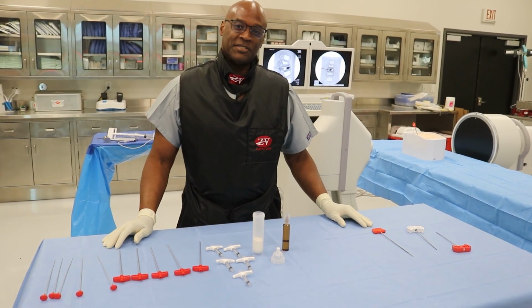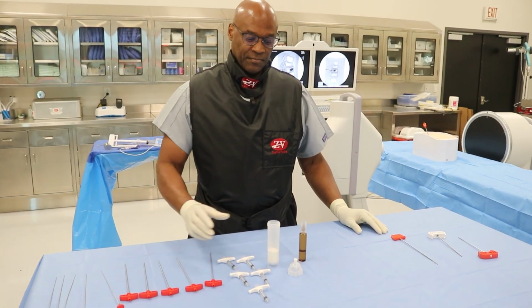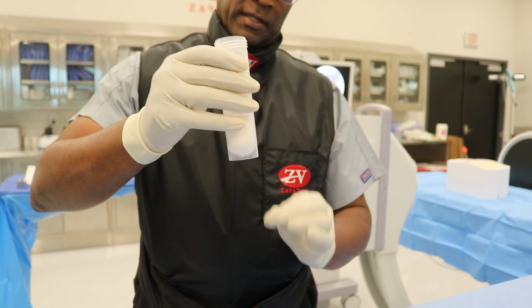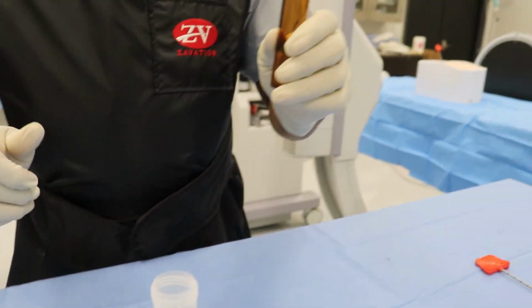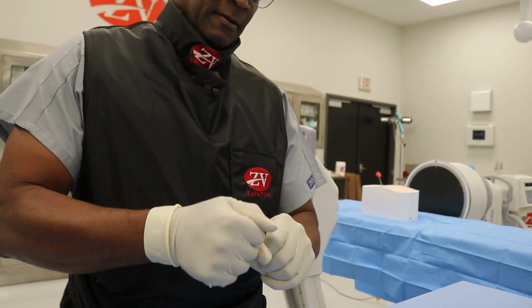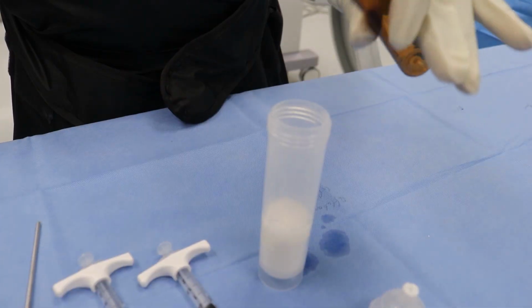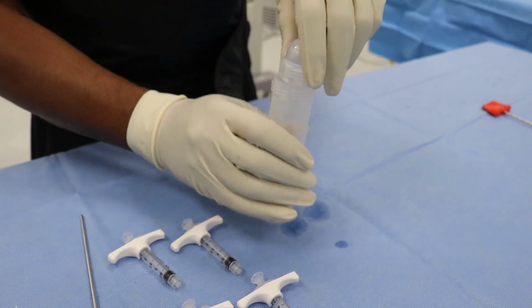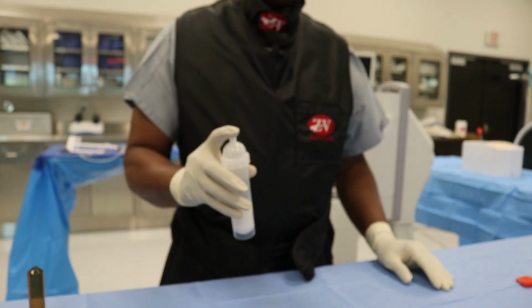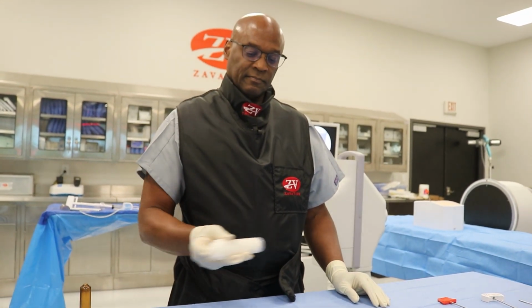The next step in the procedure is the mixing of the OsteoFlex cement. This has 3 components. There is the cement powder, and there is a metal ball inside. There's the liquid catalyst, and what we want to do is pour the liquid into the container. You place the cap and shake for 15 seconds. You let the ball do the mixing.